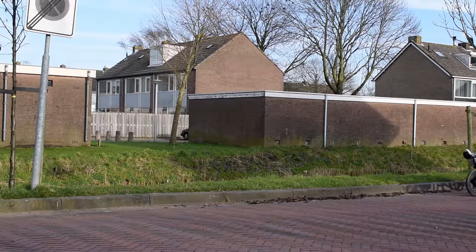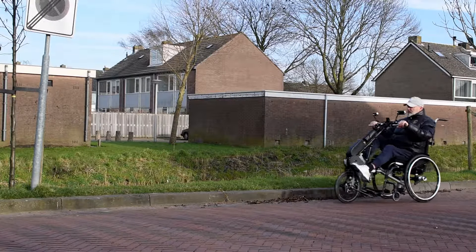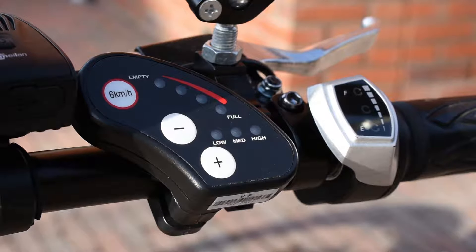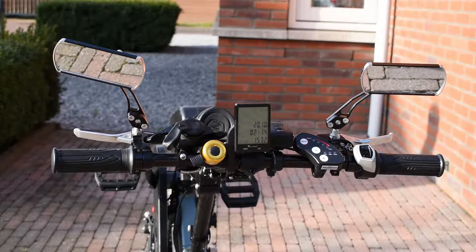With the EasyLegs Connect, you can propel your wheelchair and train your legs at the same time. The EasyLegs Connect can be equipped with electrical pedal assistance, and can be used by people with strongly impaired leg function.